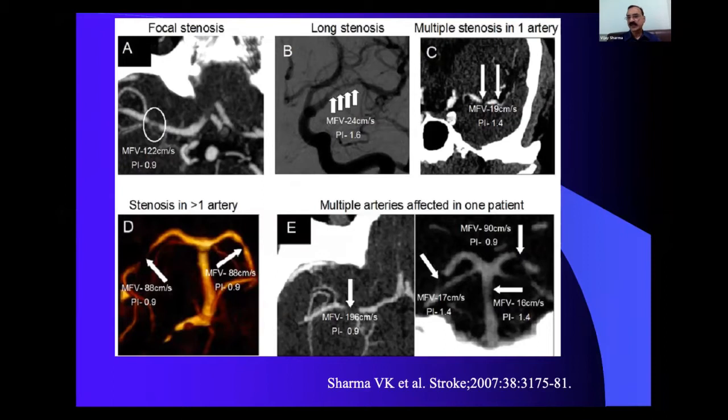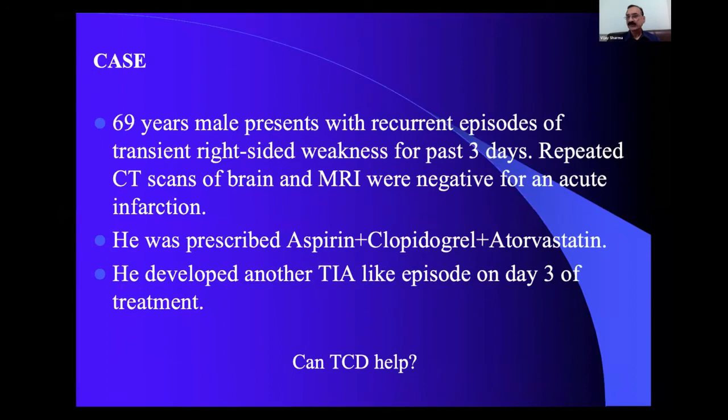This is where you need to be careful when you are using TCD, but it definitely guides you what is going to be most helpful investigation for you if you want to select one investigation. So let us start with how we use TCD in some decision makings.